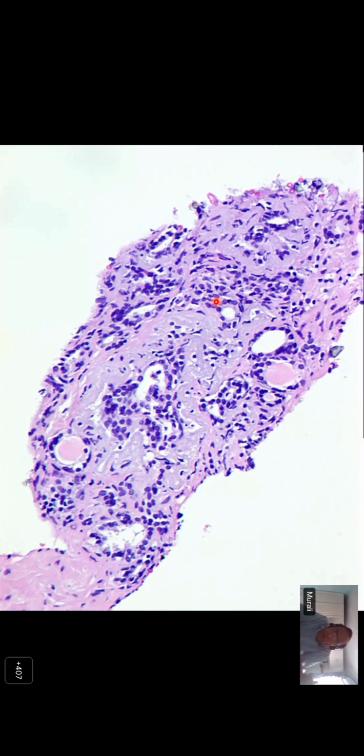The other point I would like to make is you talked about the stromal reaction. Unlike other cancers, in all other tumors, if you see a desmoplastic reaction, you take notice and think that desmoplasia suggests malignancy. In the prostate, it is the opposite.